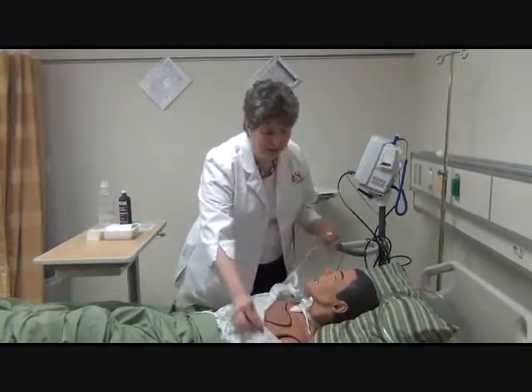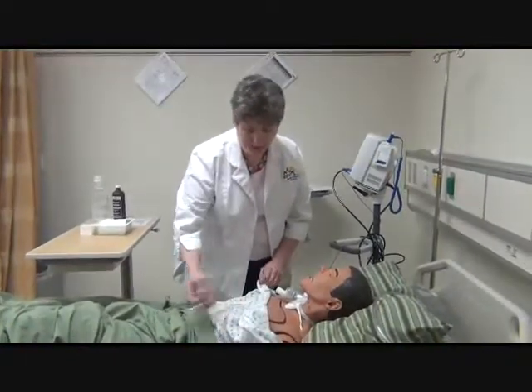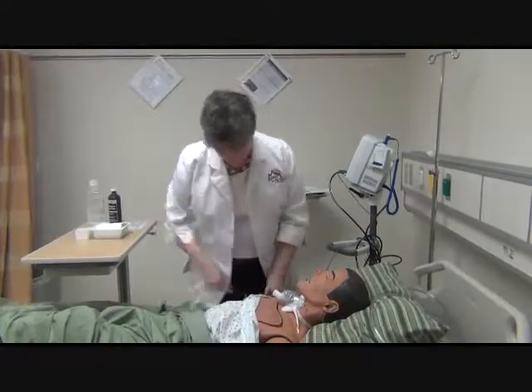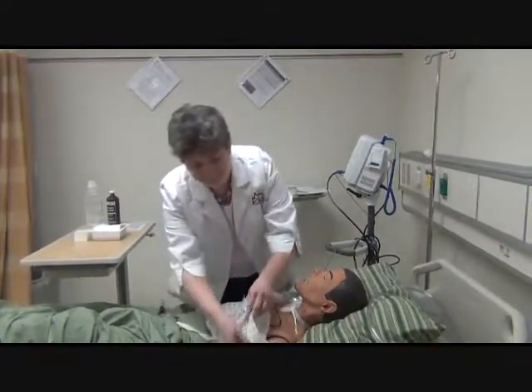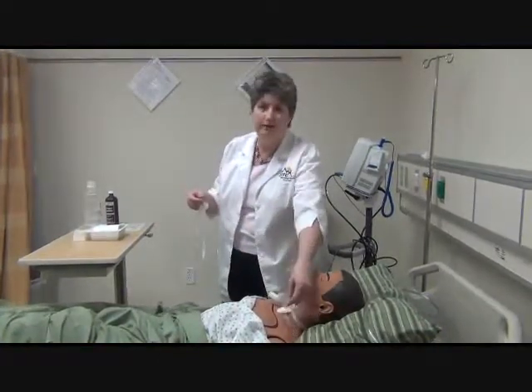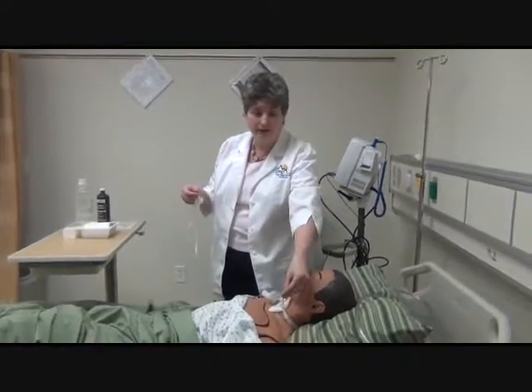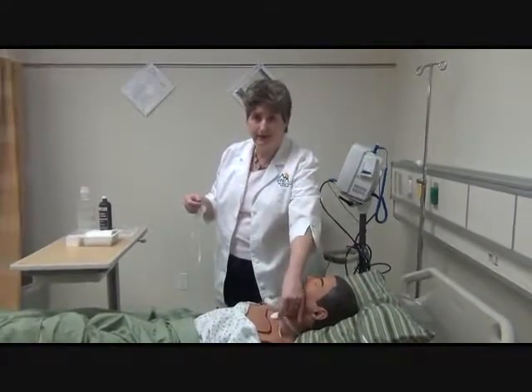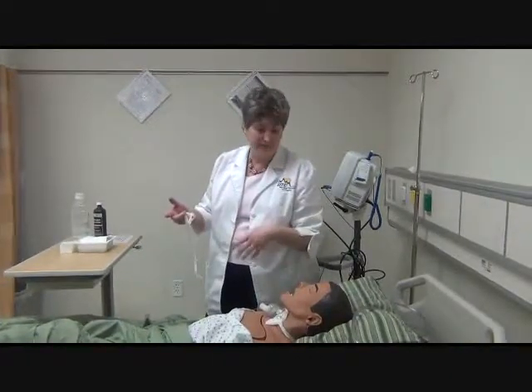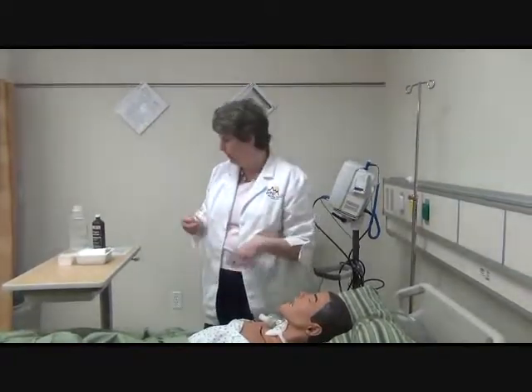If they have on a patient gown, these two ties look very similar. So I was taught to make sure that I put the gown down and put those ties away. And I would caution to always make sure that you understand when you untie anything on the trach, if you have these cotton ties, to make sure you're not getting a gown. There have been incidences where this gets untied and patients' airways come out during the procedures or after the nurses left the room because they inadvertently messed with the wrong one. So you don't want that to happen.